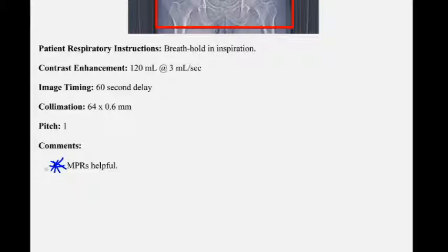and basically allows us to demonstrate how well the patient's intraluminal filling and function of the intestines actually are. And it's really to aid in diagnosis of Crohn's disease, things like this. So all of this has to be accomplished outside of the CT suite. And so typically, departments kind of do this, once again, a little differently.